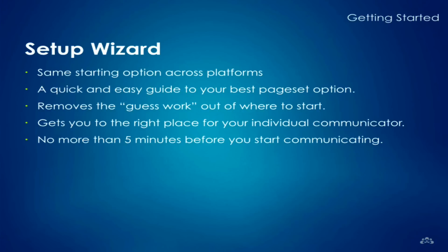So you can go through a set of guiding questions that will help determine perhaps the best page set for you to start off with. You do also have an option to actually go straight to a page set if you're already aware of the one that you want to use, or perhaps you've purchased a premium page set that you're wanting to use with an individual. But let's head on over and have a look at that setup wizard and how that works.